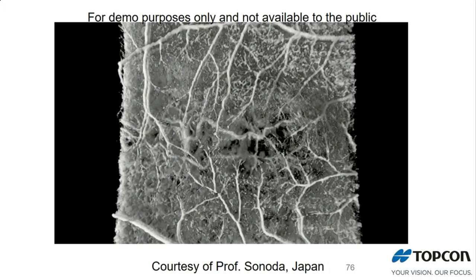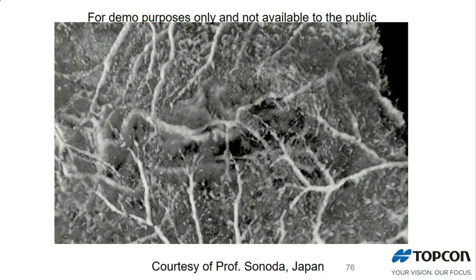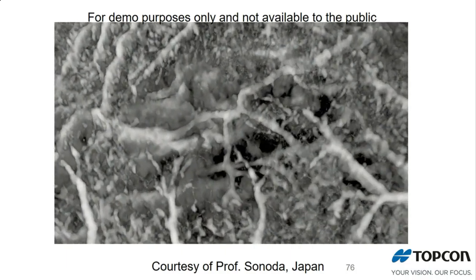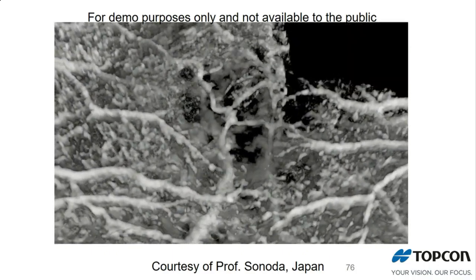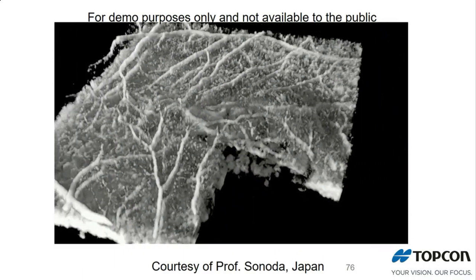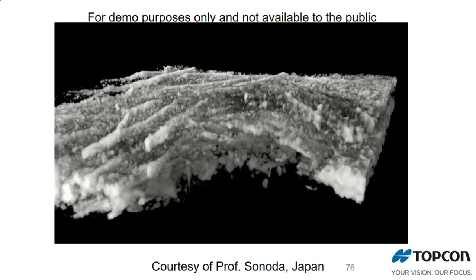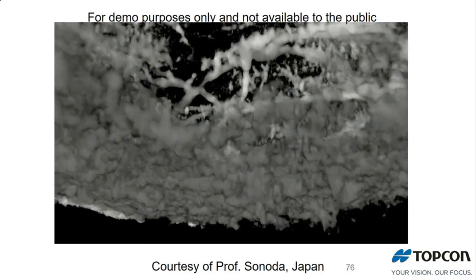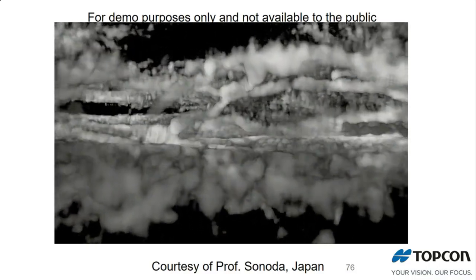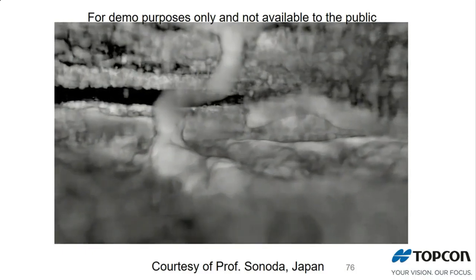You can see where the dome is of the RPE detachment and how the vessels of the neovascularization sort of make a tent over that dome. And again, you can fly into it, and you can see where the vessel is coming from in the choroidal vessel. Again, this is just a research software, so this is not on the instrument.